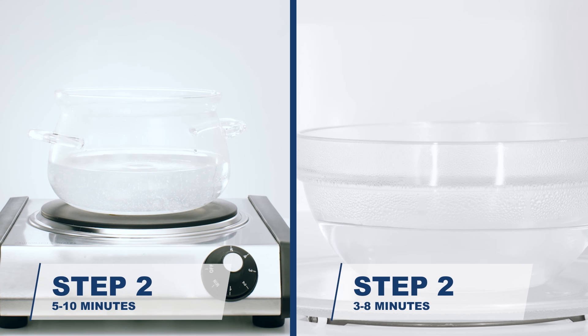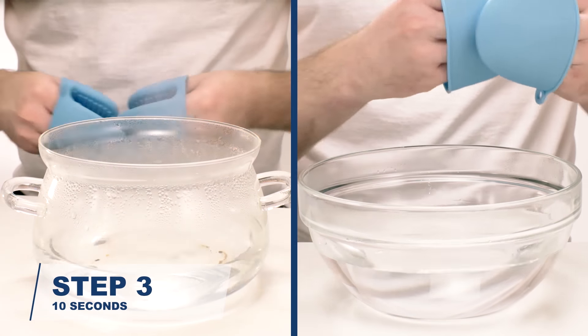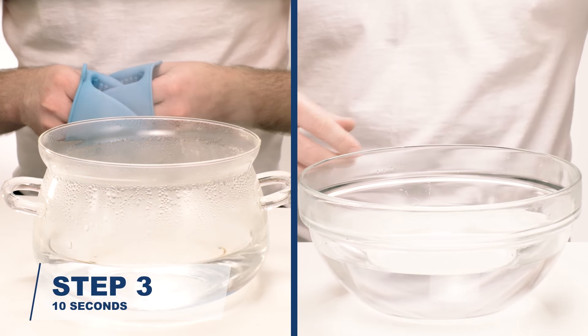Using a pot on a stove or microwavable bowl in a microwave, heat at least one and a half inches of water. Make sure to achieve a rolling boil. Carefully remove your pot or bowl from the heat and place safely on a flat surface. Let rest for 10 seconds.